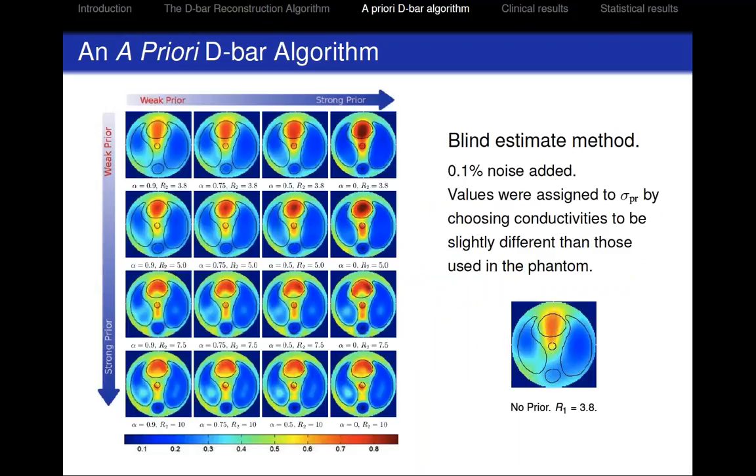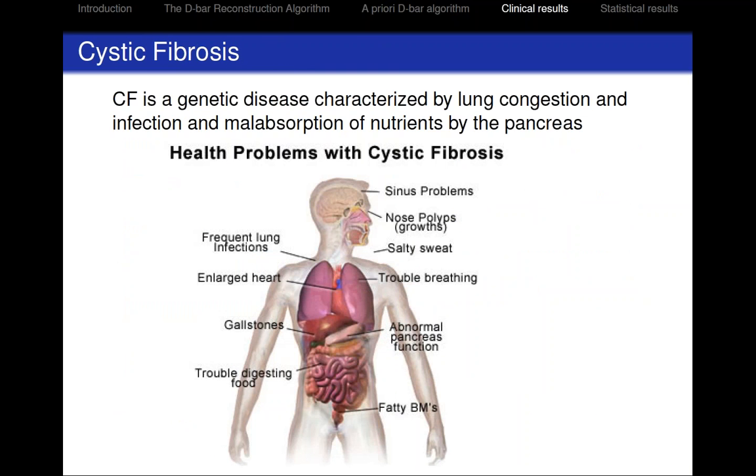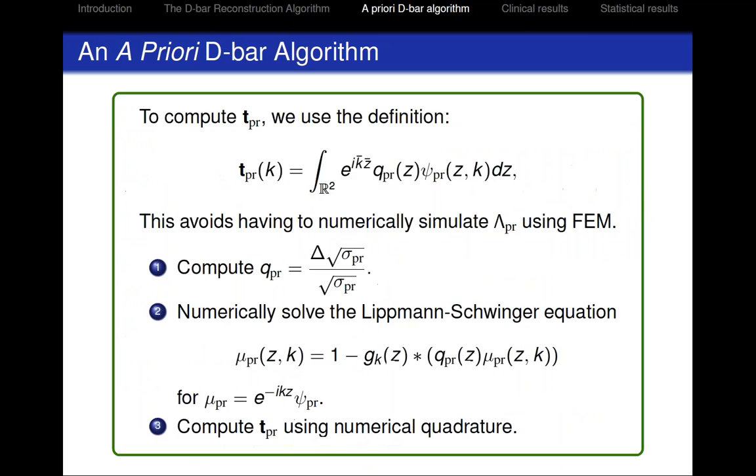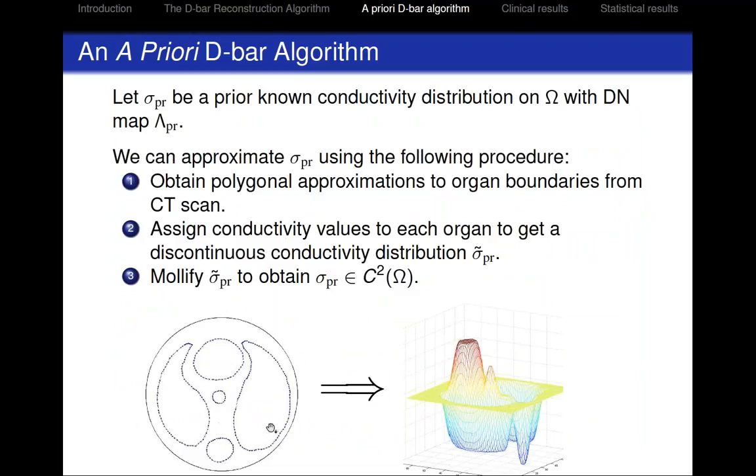So just to quickly show you how it works. Oh, just a second, there's a slide missing, actually. I want to see if it's out of order. No, I don't know where it went. That's strange, but it's okay. The slide that's missing shows you the actual conductivity distribution, but it's all right because it's drawn in anyway. So you can see the boundaries. It's the slide I showed you before, really, this one.